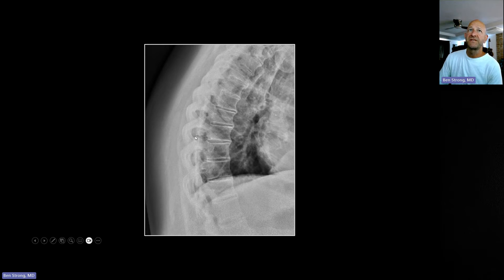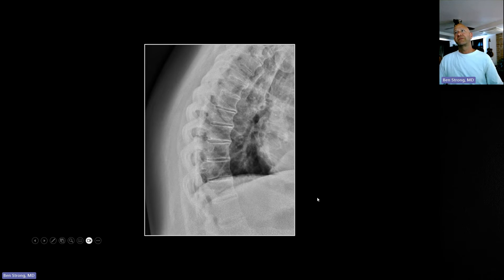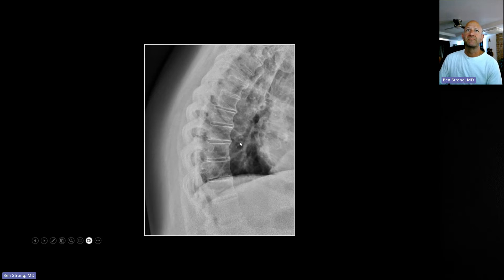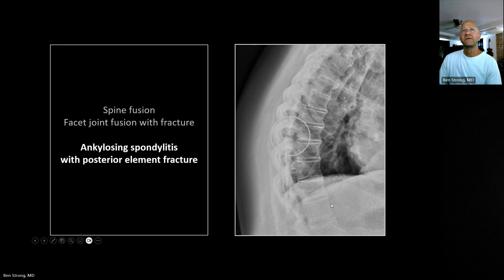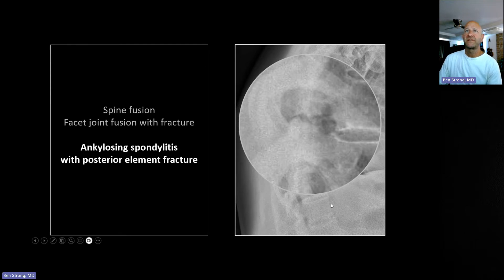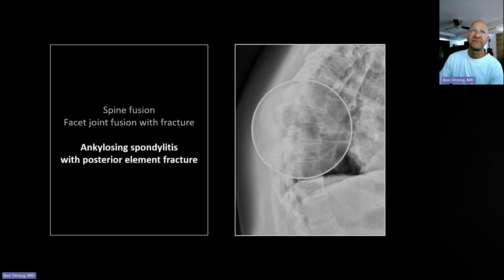This is a posterior element fracture — look at that, it's going right through these fused facet joints right there. I would suspect there's probably also an occult fracture sitting in that intervertebral disc space or breaking these syndesmophytes, because it most likely passed all the way through. So that is a posterior element fused facet joint fracture.